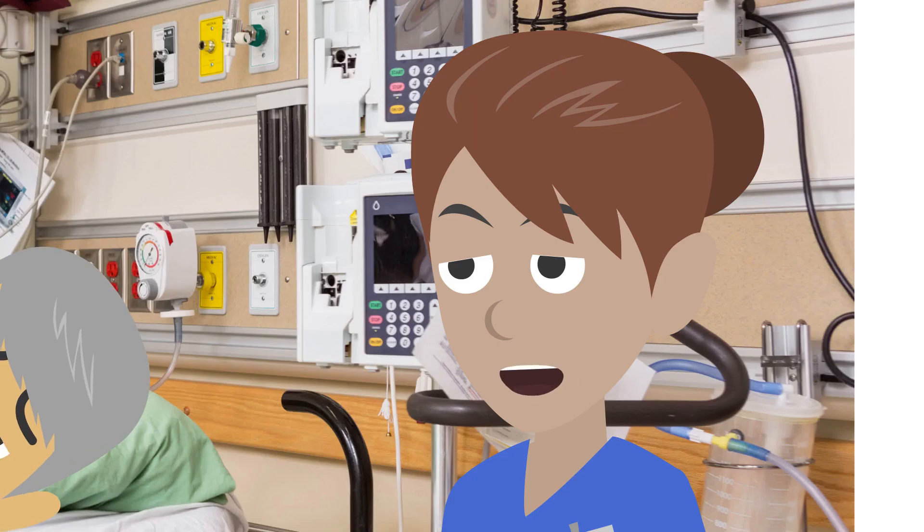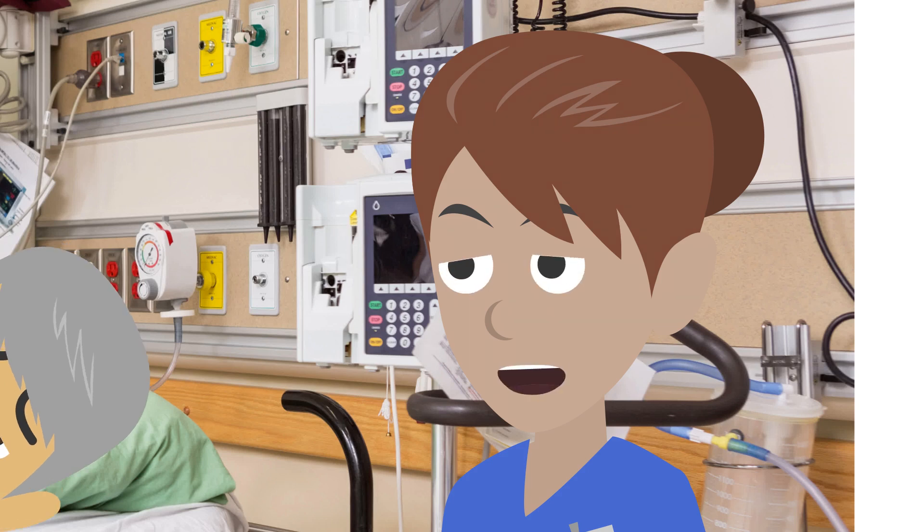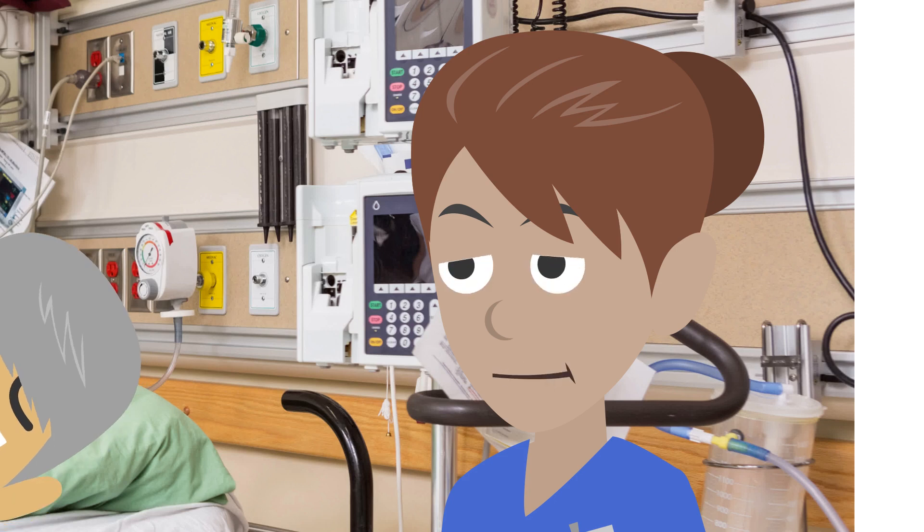I'll be feeding a narrow tube through your nose into your stomach. The tube will stay in place until your swallow reflex returns and it's safe for you to eat and drink normally again. Before I insert the tube, I'll measure the length of the tube that I need to insert. I do this by measuring the distance from the tip of your nose to your earlobe and adding the distance from your earlobe to the bottom of your breastbone. Then I'll add between 5 and 10 centimetres. Finally, I'll take note of the measurement mark on the tube so I know how far to insert it.